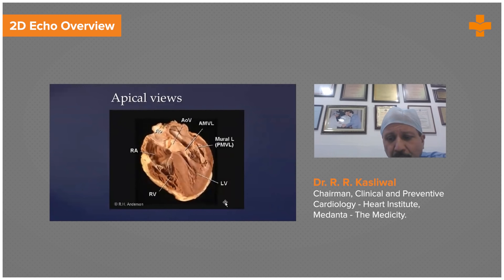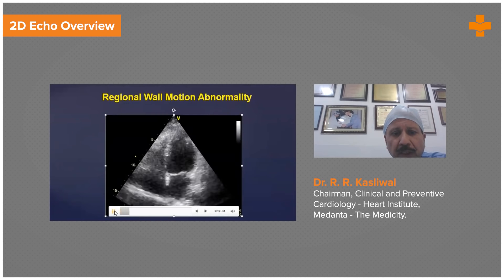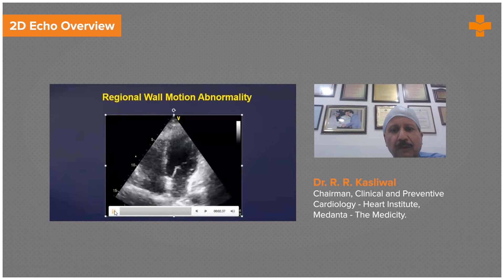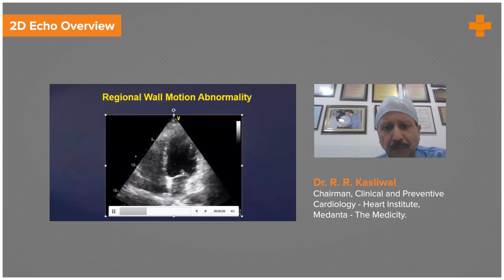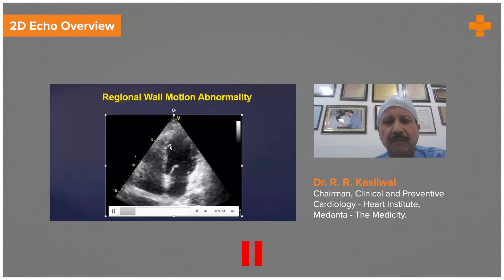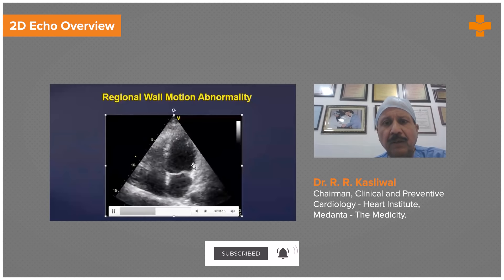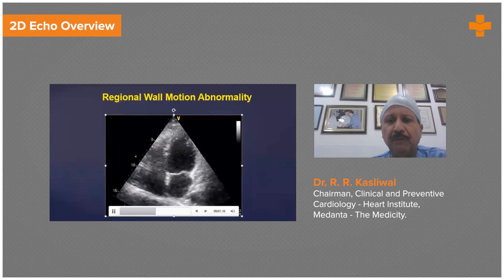These are the apical views. You can see very clearly the aorta, RA, RV — the same things you can see in the apical four-chamber view of a patient. While the patient is comfortably lying, you can see the LV cavity, the mitral valve, the left atrium, the right ventricle, the right atrium, the interventricular septum, and the complete walls. In many views, all 17 segments can be visualized.